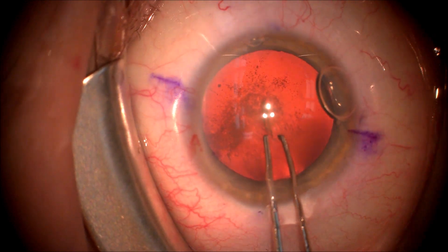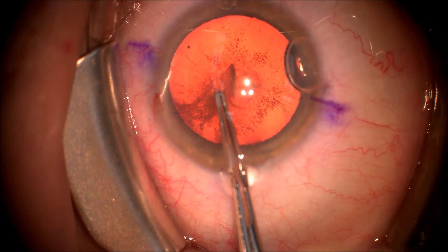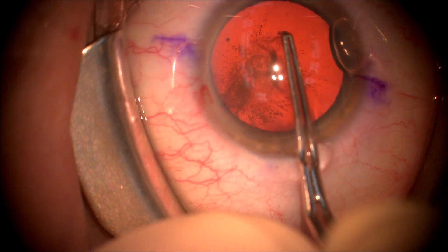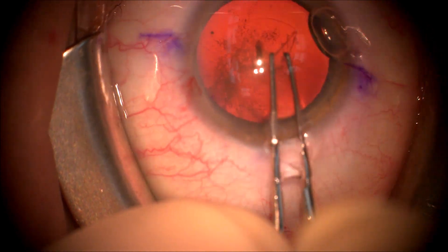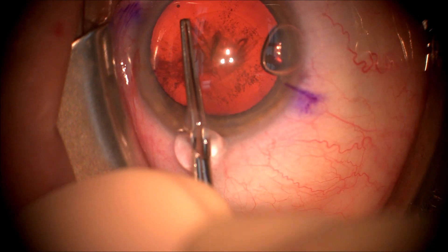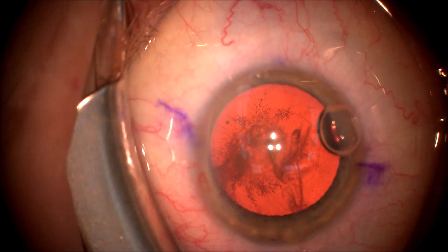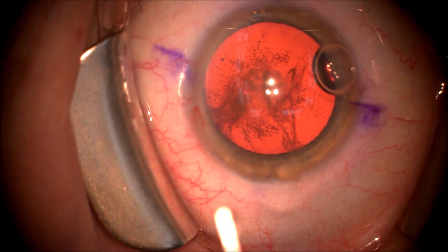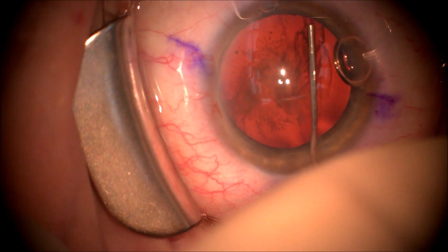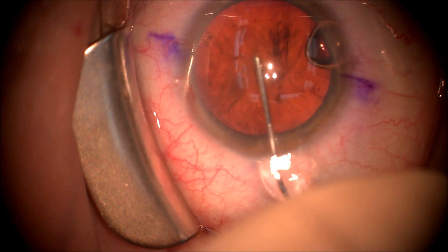We're going to proceed with the capsorhexis using a Utrata forcep to make a round four to four-and-a-half millimeter capsorhexis that is good to capture the new six millimeter Vividity lens. It's important to get a good overlap when taking out the cataract and putting in an intraocular lens implant, as this gives the lens a stable position.